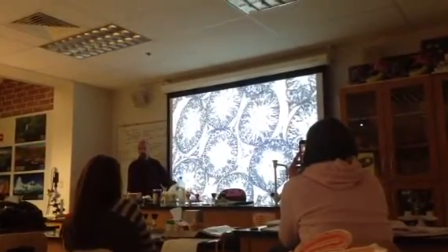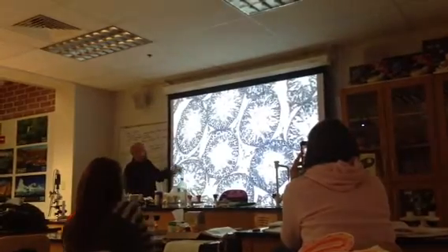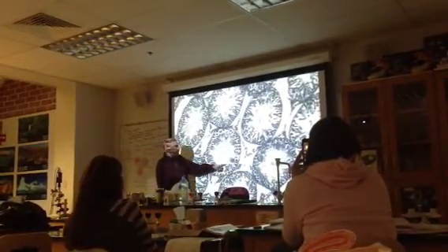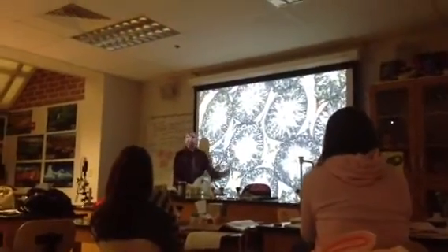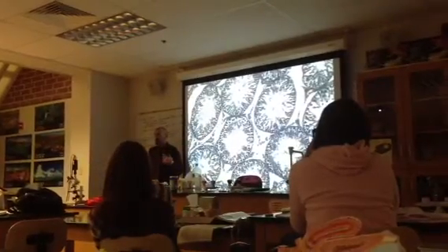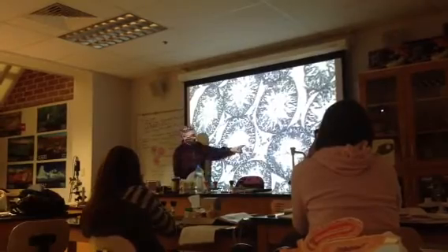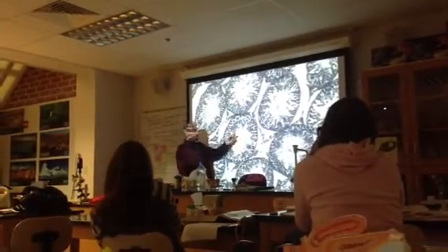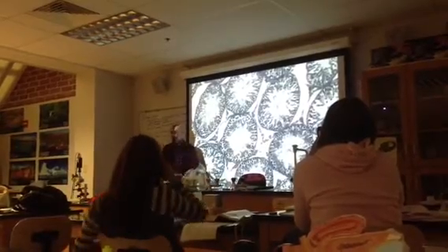And haploid, 23 chromosomes. By the time you're at the periphery of the lumen, now they've differentiated into spermatids. Spermatids are still N or haploid, 23 chromosomes. So literally the cells right here are spermatids. And they're not quite sperm yet, they're still in the process of developing.